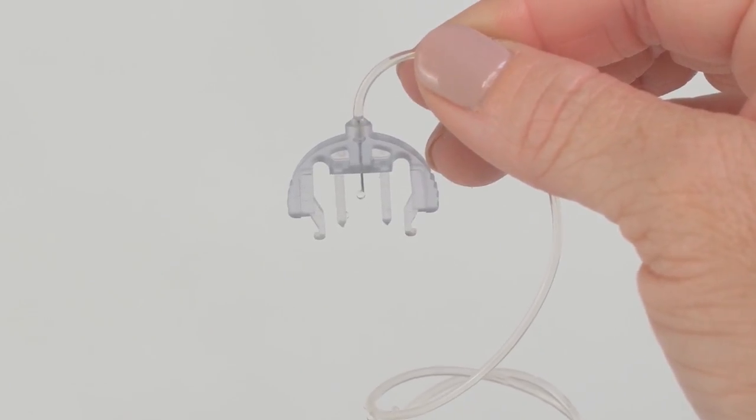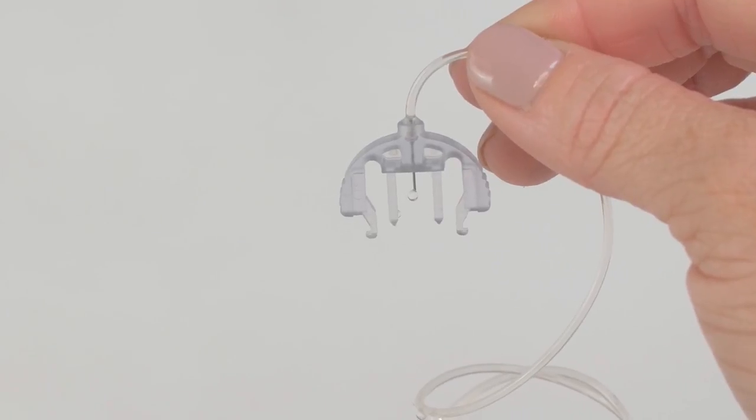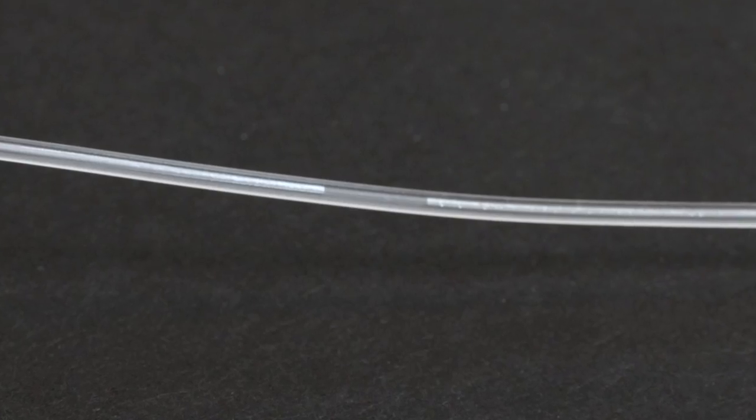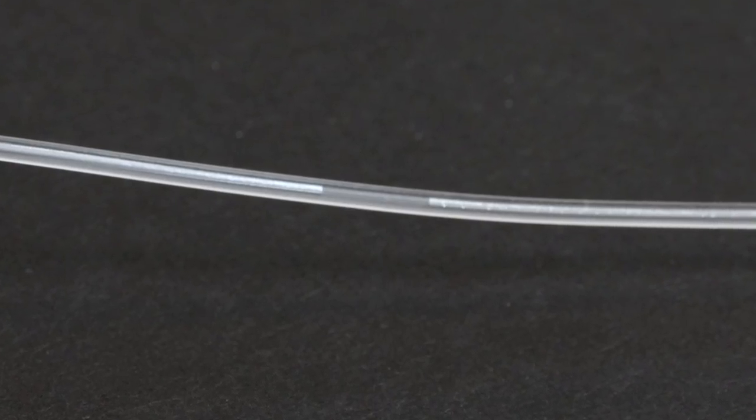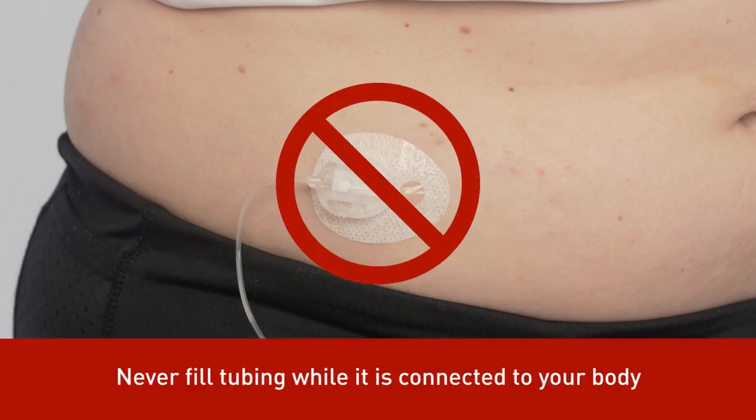When filling tubing, hold the connector needle pointing down. Fill until you see drops of insulin come out of the connector needle. Make sure there are no gaps of air in your tubing to reduce the possibility of interrupted insulin delivery. Never fill your tubing while your infusion set is connected to your body.